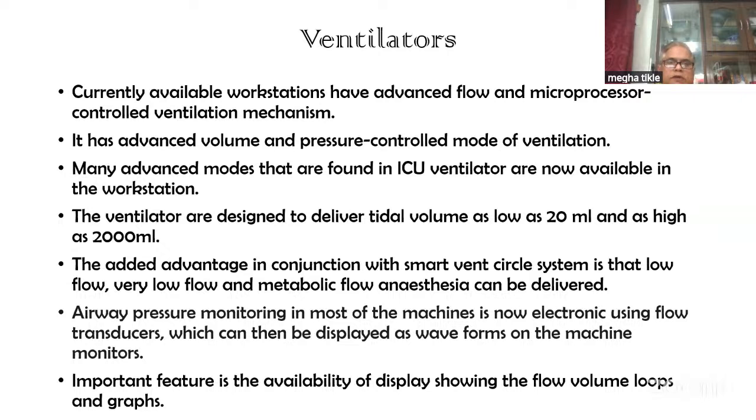Now, the currently available workstations have advanced flow and microprocessor controlled ventilator mechanism. They have both volume and pressure controlled modes of ventilation. All the modes that are found in ICU like SIMV, pressure controlled SIMV, volume controlled ventilation, pressure guaranteed, regulated volume control, pressure support pro or pressure support ventilation, everything is available. So we can use them as we find suitable for the patient.